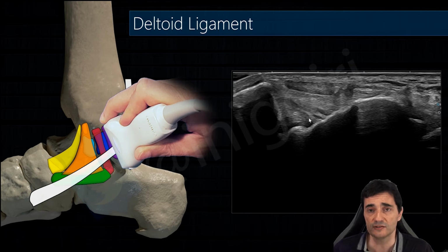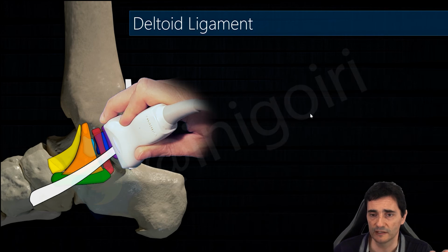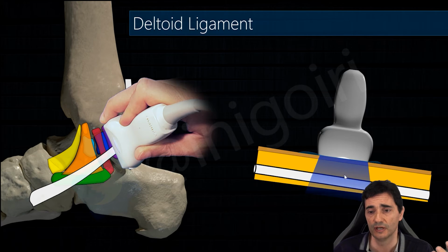As we saw yesterday, usually the deep component has a tiger shape pattern, and maybe you don't notice it very well in this image. And we can use a small trick I'm going to show you. Usually when you perform an ultrasound, if the probe is perpendicular to the structure, so the sound has a perpendicular direction, the tendon and the anisotropic structures are very, very hyperechoic, like the tissue surrounding these structures.